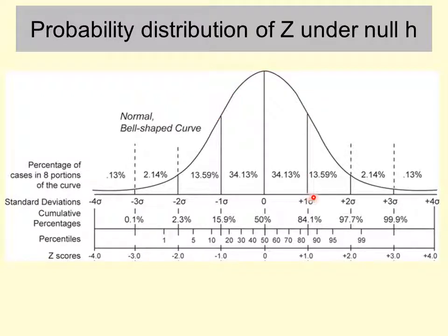The total proportion of Z-stats that fall between -2 and 2 is about 95%. So if an actual Z-stat is larger than 2 or less than -2, then it's only 5% likely we could get a value that large by random variation, random sampling effects.